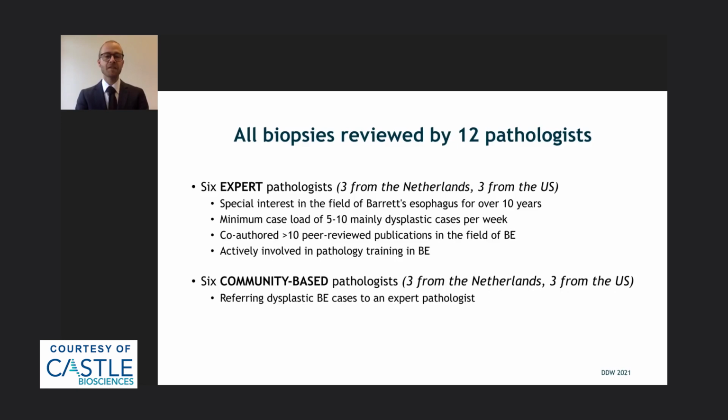All biopsies were reviewed by a total of 12 pathologists. On the one hand, we had 6 expert pathologists, 3 from the Netherlands and 3 from the US. These expert pathologists have had a special interest in the field of Barrett's for over 10 years. They have a minimum caseload of 5 to 10 mainly dysplastic cases per week and have co-authored more than 10 peer-reviewed publications in the field of Barrett's.